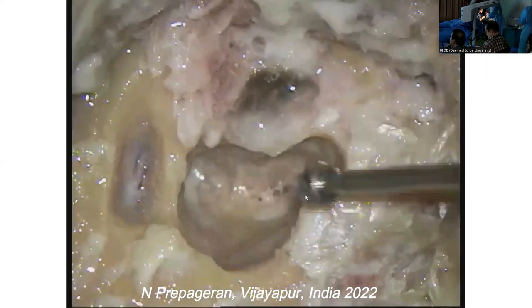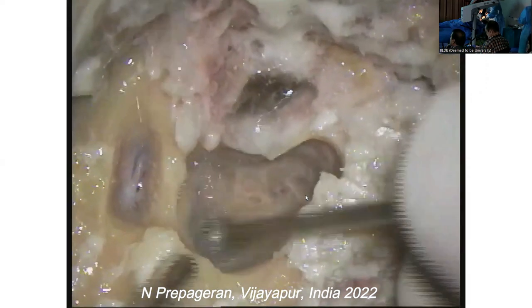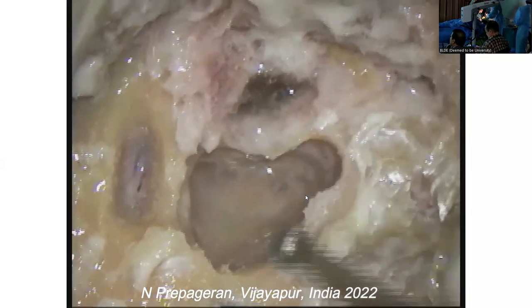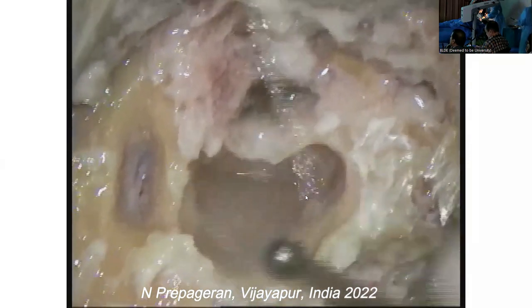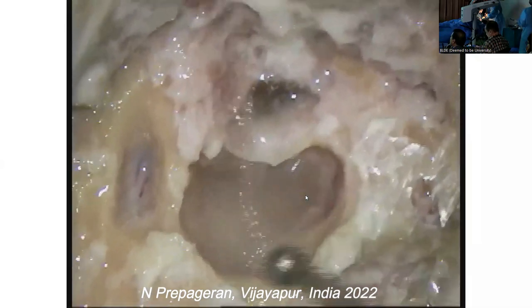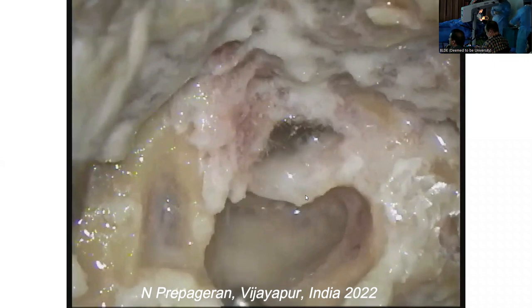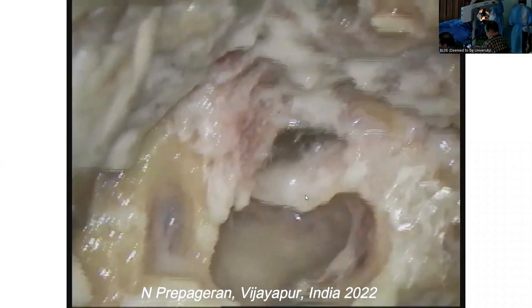The sclerotic mastoid, but fine. Let's see what we can do. So what I want to do now is to make the space bigger. One of the problems I have is the shaft is very long, so I find it difficult to control the drill because the shaft is very long.